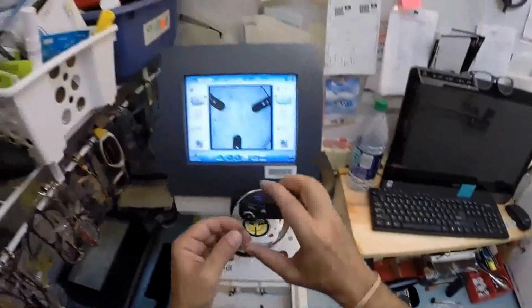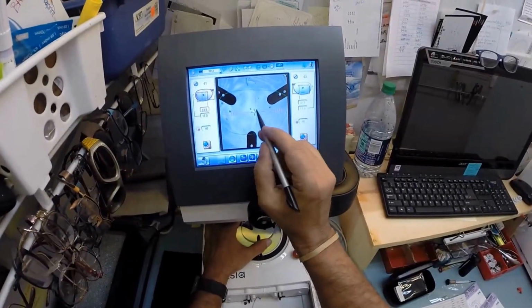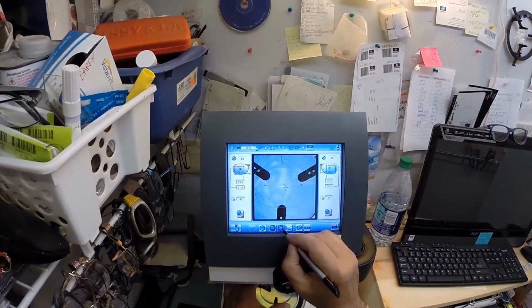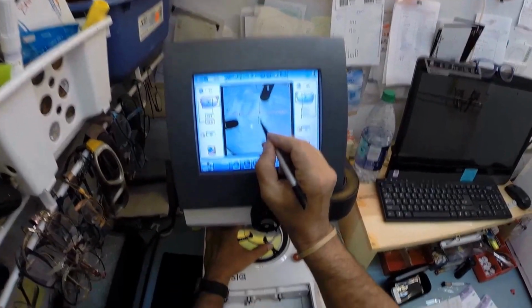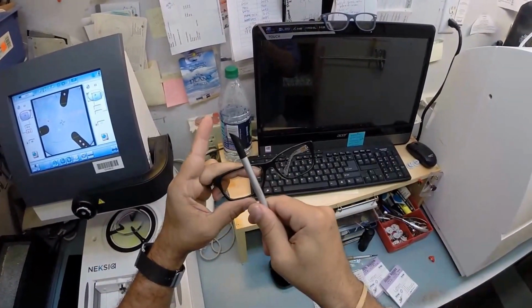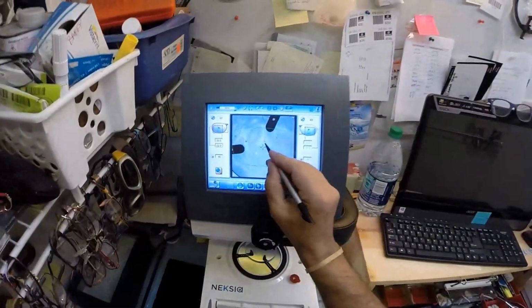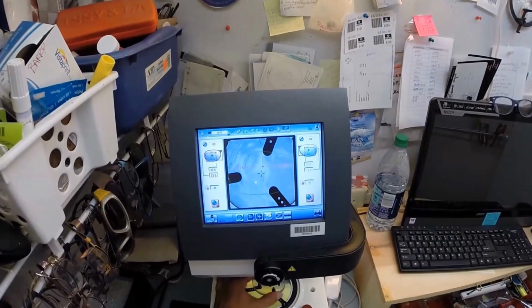Now the reason why I put those 3 dots on your lenses, it has to be oriented just right or you're not going to see as well. So hopefully you can see those 3 dots there. That's your optical center. And actually I want to raise the optical center in your frames there. And the blue cross is the geometric center of your frame. If you were to measure vertically and horizontally, that blue cross is going to be dead center in your frame. Now your eye is just inset from there, so that's going to go on that orange line. I get everything lined up just perfectly.